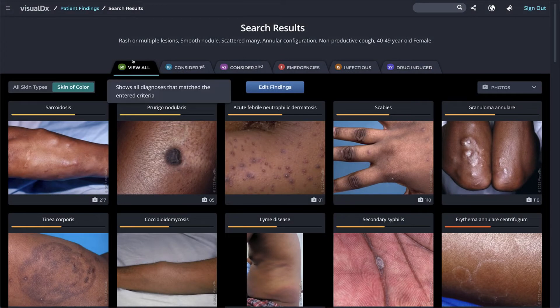View All shows every diagnosis included in your results. In most cases, the View All tab is the default tab unless you enter specific findings. We'll discuss those in a moment.